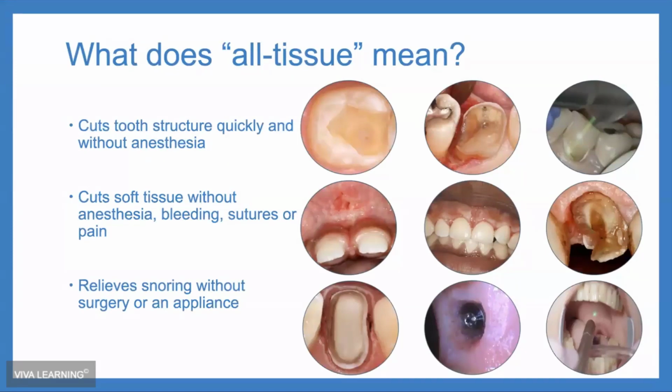The first thing I want to introduce to everyone, of course, I'm not sure what everybody's level of expertise is with lasers, but if you're like me, when I heard laser 7, 8 years ago, I always assumed they were just soft tissue. They were ways to manage the gingival tissue when I'm prepping a crown. And really, that was the box that I put lasers into.